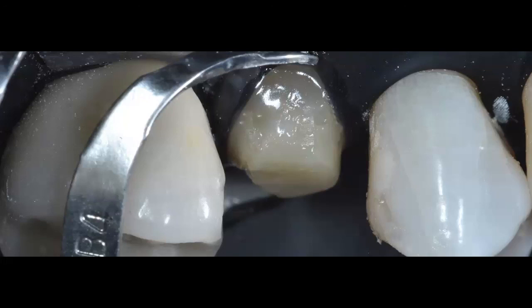But what I do tell them is, I really don't see this restoration having any issues, to be honest with you. But what I do tell them is that there is a fail-safe mechanism within that core buildup, which is built with that fiber that you saw me using. And if the crown comes out, I can either try to rebond it or I can do a new crown, because I would see it would be very rare that this is going to be a catastrophic fracture compared to a more traditional approach with post and core, which normally, if there's any failure, it's going to be a catastrophic failure, and immediately the tooth is going to need to be extracted.